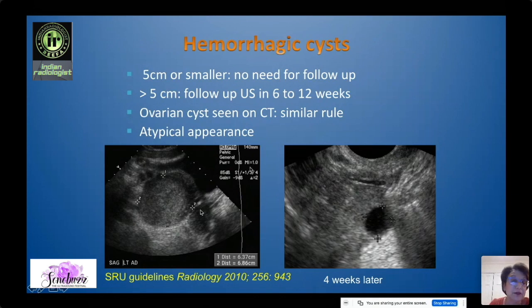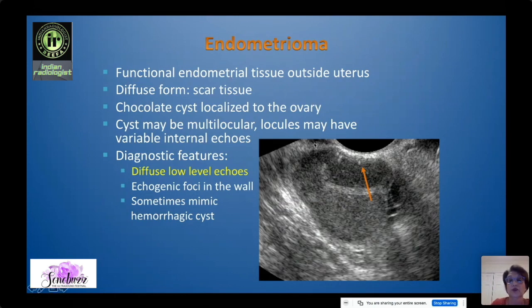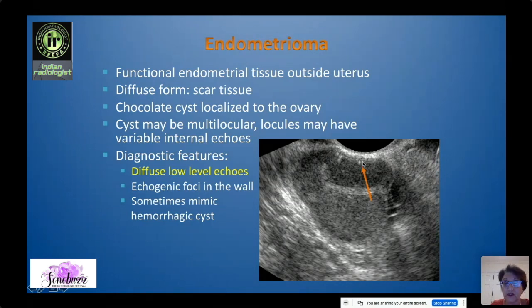If a hemorrhagic cyst has an atypical appearance — looking more solid — then you do get follow-up, and resolution will confirm it was hemorrhagic. Another lesion we can diagnose with confidence is the endometrioma, which is functional endometrial tissue outside the uterus. The chocolate cyst is localized endometriosis of the ovary. They have a very typical appearance: unilocular or multilocular with diffuse ground-glass low-level echoes. Look also for echogenic foci in the wall, which are very characteristic of endometriomas, likely from hemosiderin from the hemorrhage.